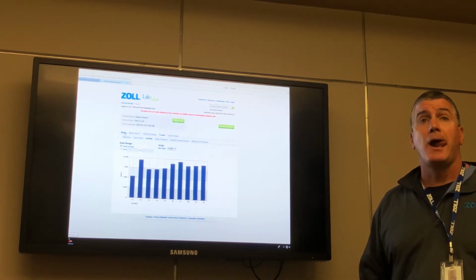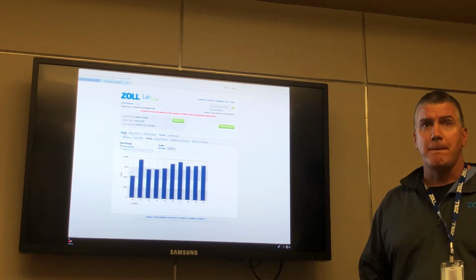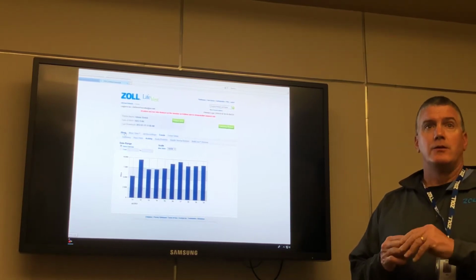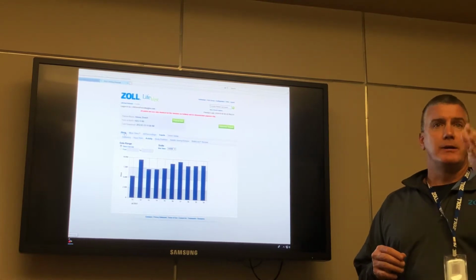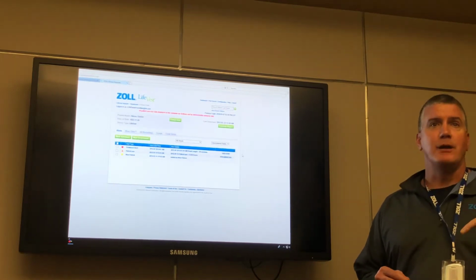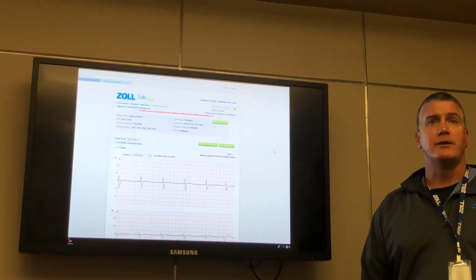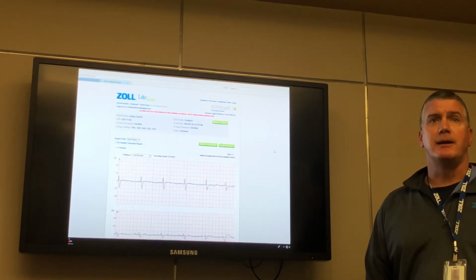So the big question is getting access to that, because you have to be on their chart as a provider in their chart, correct? Well, yes. So we set you up in LifeVest Network. Then, let's say another one of your providers ordered the vest, and we haven't linked that patient to you yet. Call me, and in 5 minutes I can have it linked over to you. All I do is make a phone call. You can say, Jim, I just need access to this patient. I'm treating this patient today, and the fact that you're treating that patient today gives you access to it.